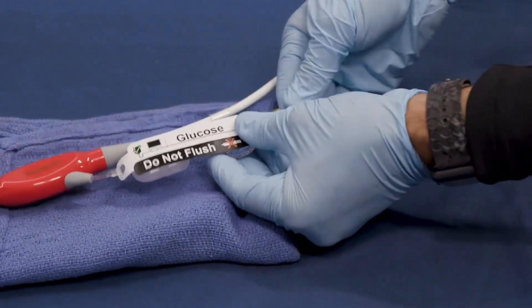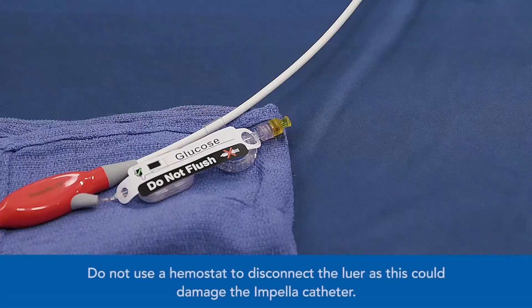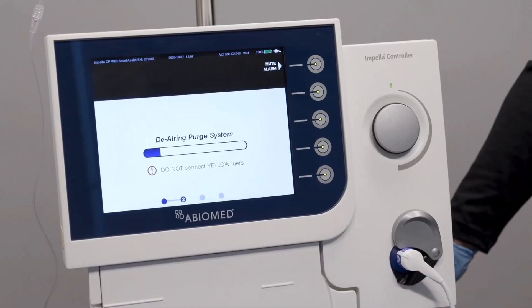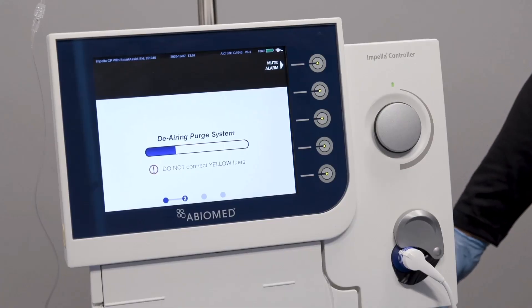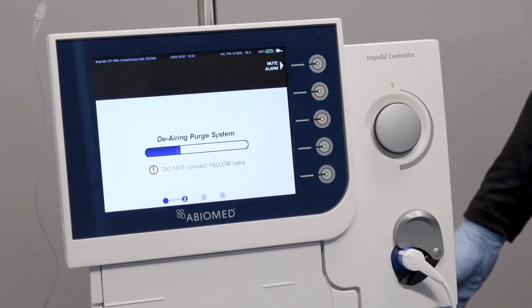Disconnect the yellow lure from the Impella catheter. Do not use a hemostat to disconnect the lure, as this could damage the Impella catheter. Once disconnected, the AIC will immediately begin to prime the tubing. A blue progress bar will appear during priming.